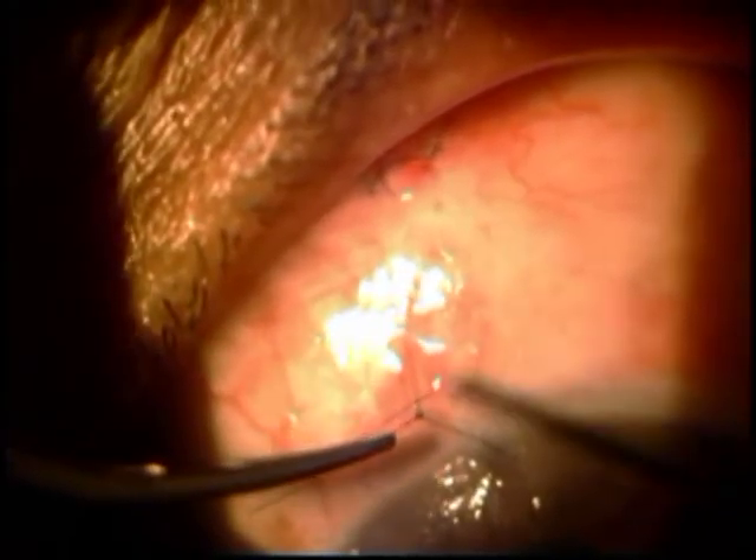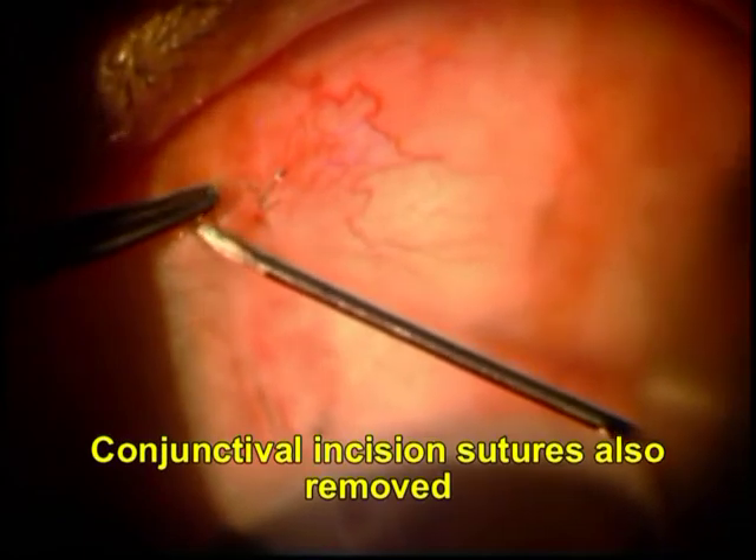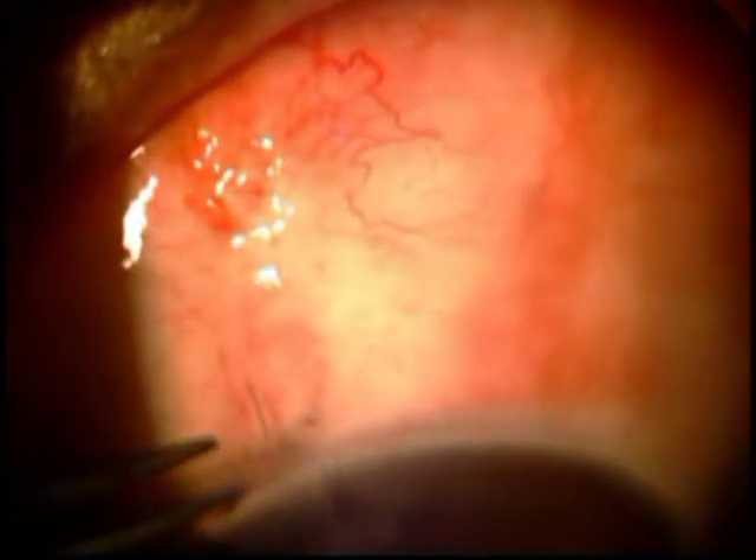This was applied at the time of surgery, and you can see that it's just a direct transconjunctival suture across the scleral tunnel, which compresses the tunnel and thereby decreases filtration in the initial postoperative period, and allows for some scar formation to happen.